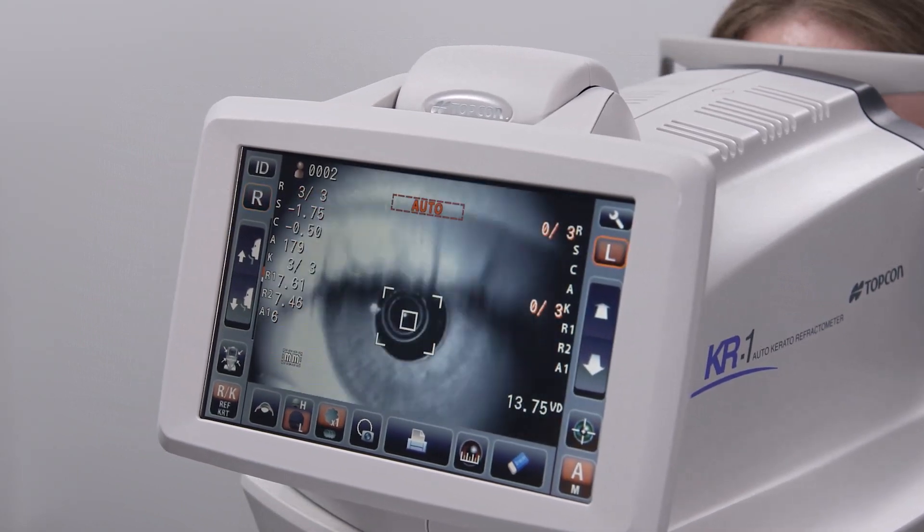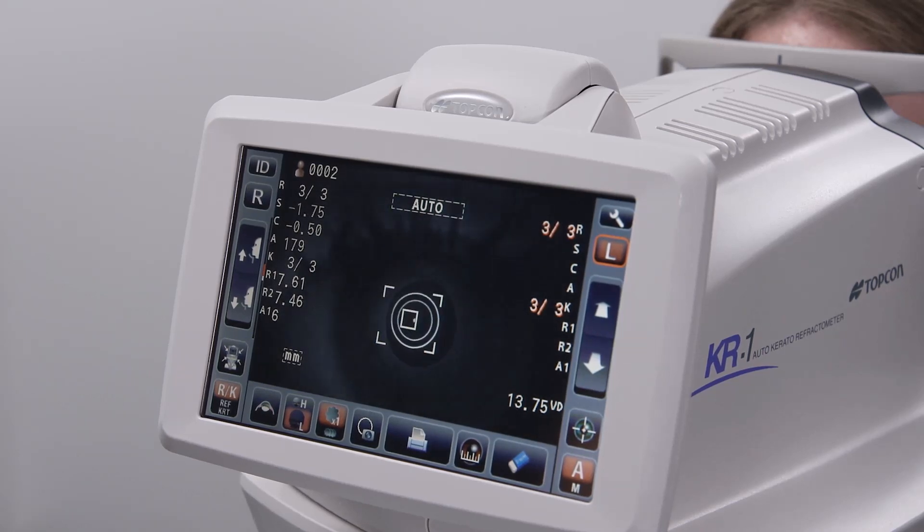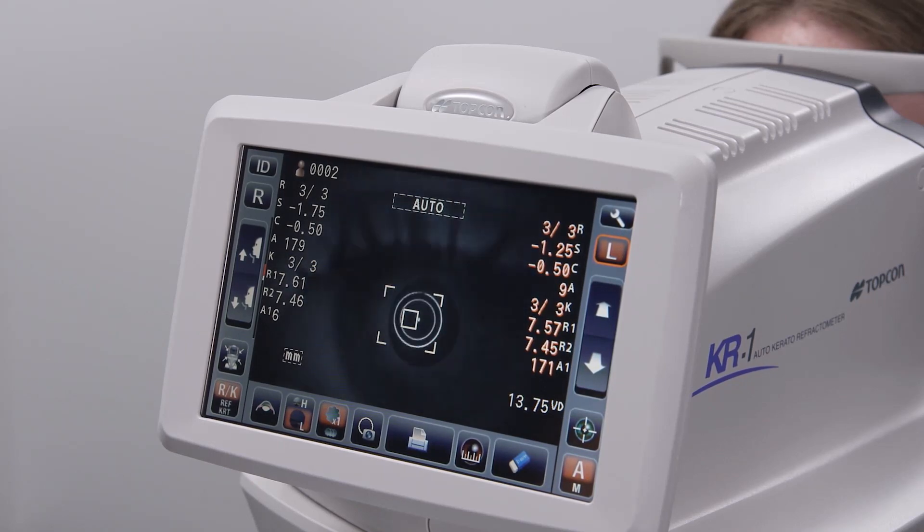After you have acquired measurements on the first eye, repeat the process on the other eye. Once you have finished with both eyes, and if your device has been configured to do so, the results will print automatically.